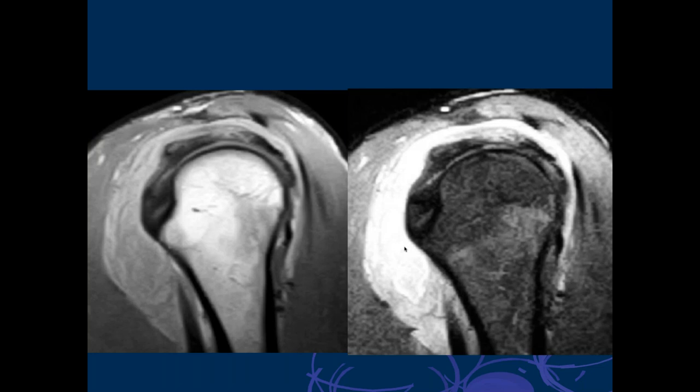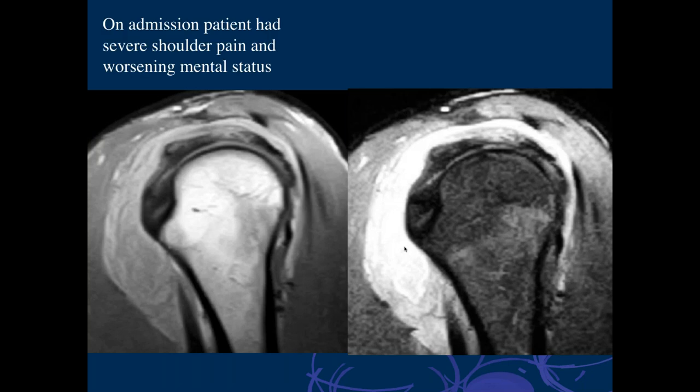Okay. There's no fever at this point? He did have a fever. Oh, okay. I mean, to be fair, you told me the patient almost died, so now I'm thinking something like infection. I wouldn't expect this much effusion in the subdeltoid bursa from a rotator cuff tear, and there's not that much fluid in the joint.